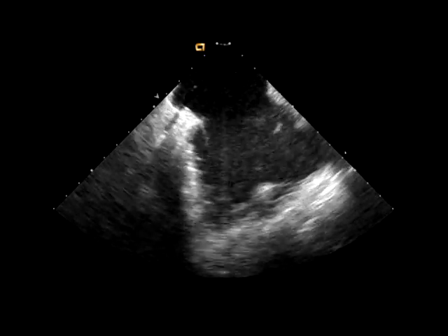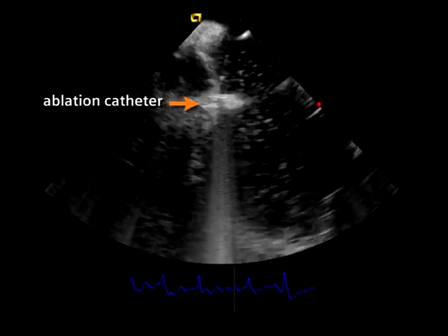There's been a revolution in the way that we choose ablation targets as ablation procedures have become more and more complex. We used to view ablation as totally determined by electrical recordings, which, if you reflect on it, is a very non-anatomic way of looking at the heart. With AccuNav and ultrasound imaging, we can see the anatomy that is generating those electrical images and see things like catheter contact and really image ablation targets for the anatomy that they provide.